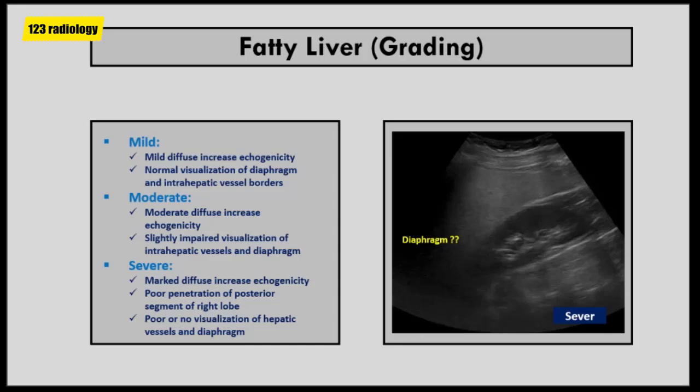As you can see in this case, the posterior segment of the right lobe and the diaphragm are not visualized. Special attention should be given to patients with severe fatty liver — focal hepatic lesions are difficult to visualize due to posterior attenuation. CT is recommended for solving unclear cases.